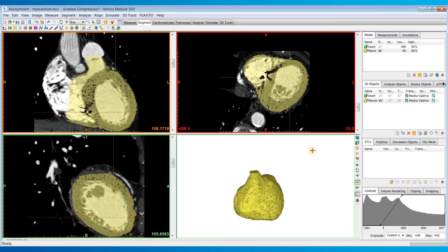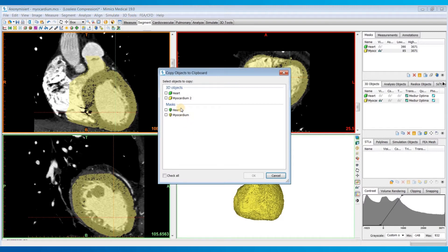I'm going to hit Ctrl+C on my keyboard, select the Myocardium 3D object, hit OK.